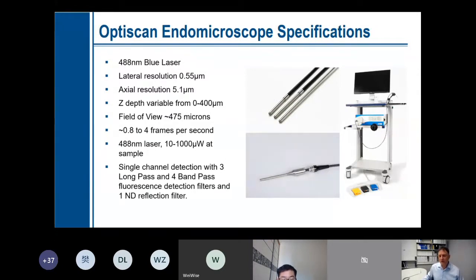We only have one objective lens, which is built in to the tip of our scanner. The laser power is also limited to 1 milliwatt, and that's to prevent users from having their eyes damaged by having a laser aperture that you can wave around in the room. The image only has one detector, which means the standard image format is grayscale, like ultrasound, MRI, or X-ray.